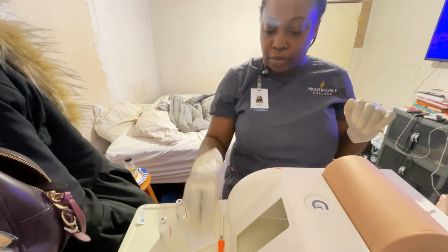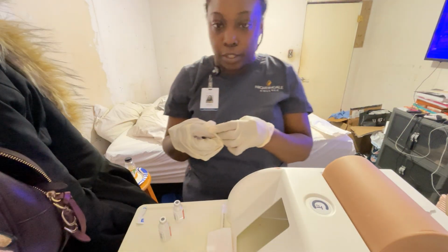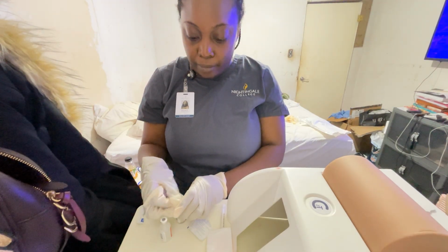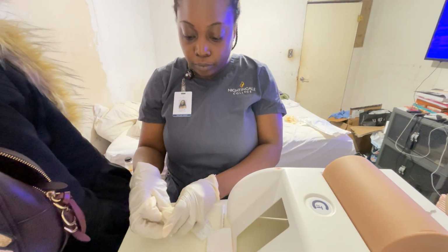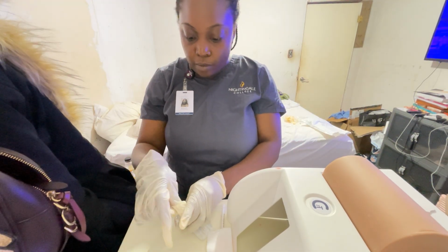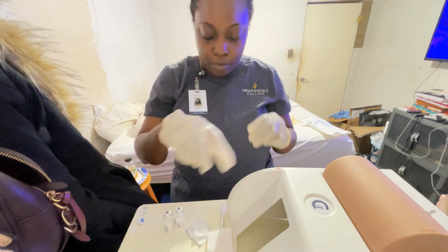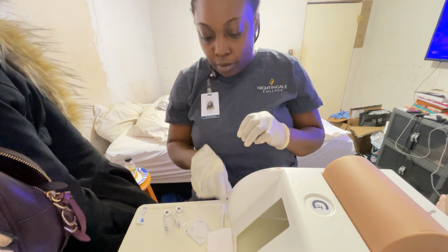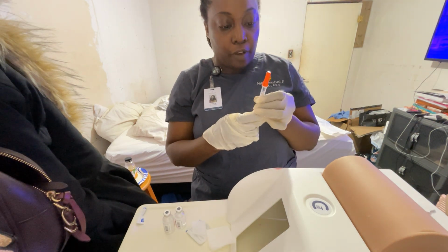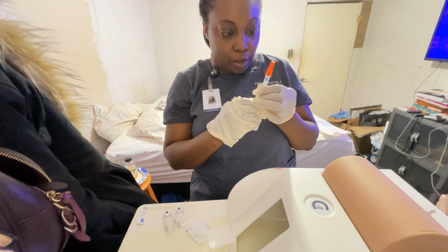So first, I'm going to start with cleaning these 2 vials with the alcohol pad. And I'm going to take my syringe and I'm going to draw up 4 units of air for the regular.